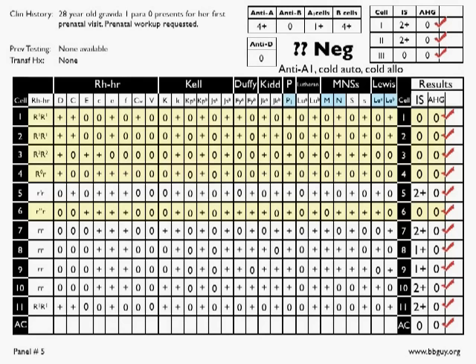Before we talk about that, let me just say this to you. If you see something like this and you are on an examination, you are absolutely justified, with completely immediate spin, room temperature reactions, some would call them cold reactions, to focus on five antigens and five antigens alone as the target of your antibody. Again, only on examinations. I would not recommend you do this in real life.